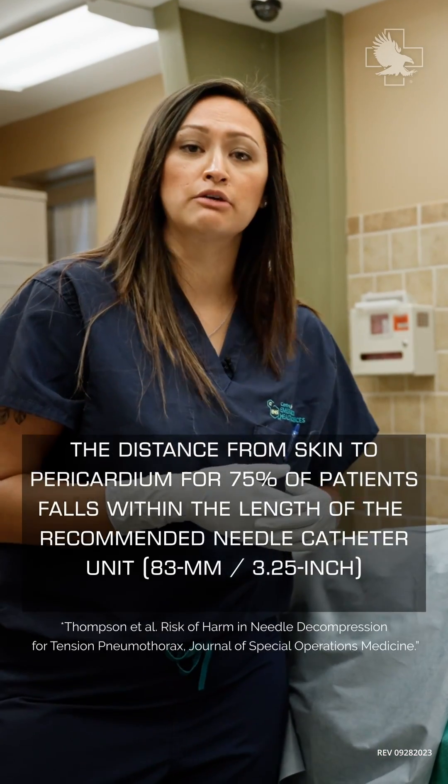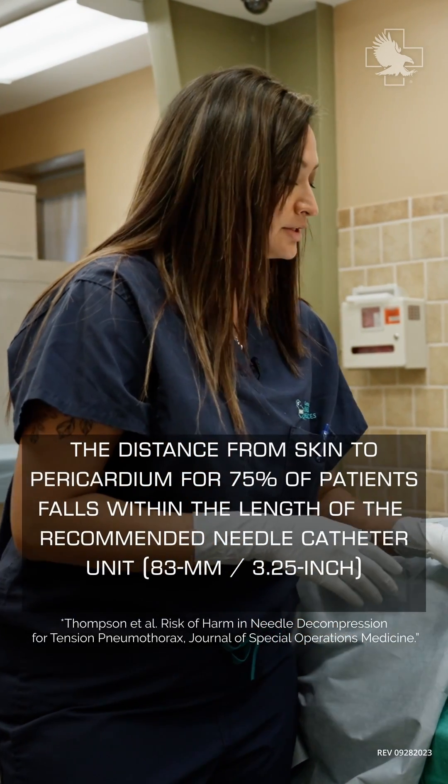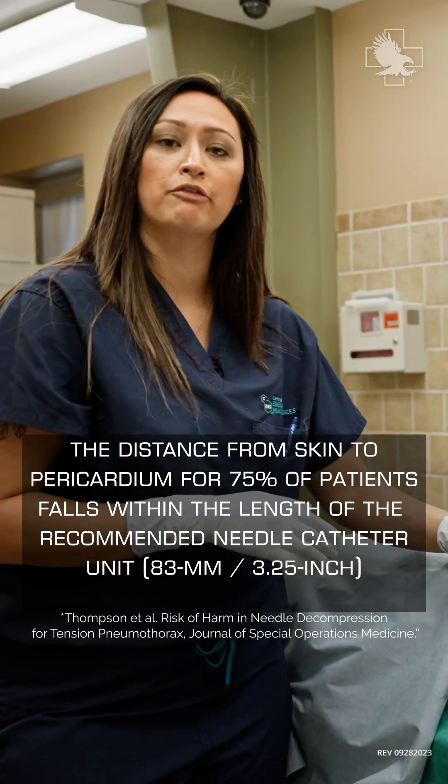One of the big dangers we're trying to avoid: if I were to continue to bury my needle to the hub on this particular side, I would be hitting into the left ventricle of the heart.